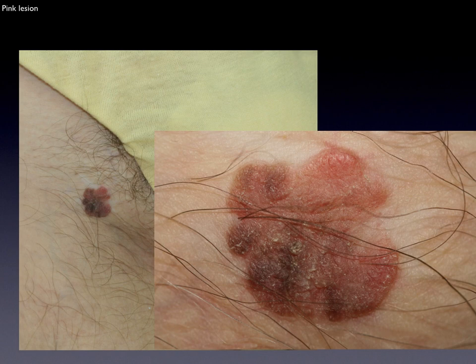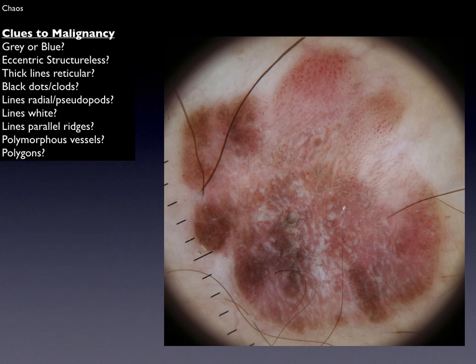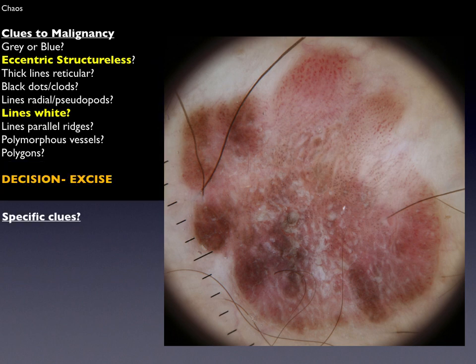Here we have a pink lesion on the groin of a 70-year-old lady, and we cannot recognize this as one of the five common benign lesions. Because it's pigmented we apply chaos and clues. This lesion is chaotic and asymmetrical: there is chaos of pattern because there's a dot pattern upper right and the rest is structureless with no basic structure predominating; chaos of color because the colors on one side differ from the other side; and chaos of border abruptness because some of the border is abrupt and other parts are gradual. As for clues to malignancy, there is an eccentric structureless area in the lower left as well as the clue of white lines. We make the decision to excise.